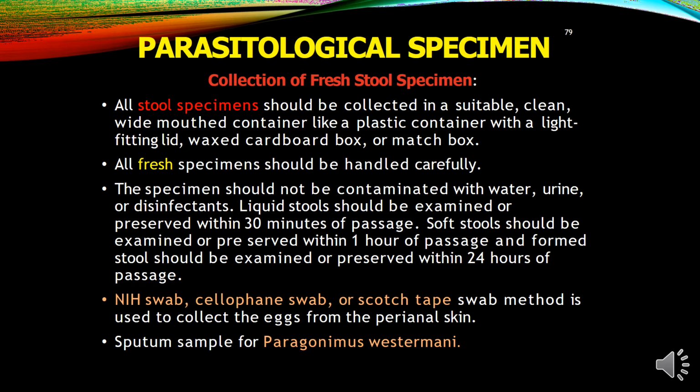Liquid stool should be examined immediately or preserved within 30 minutes after passage. Soft stool should be examined or preserved within 1 hour of passage. The NIH swab and cellophane tape or scotch tape technique is used to collect eggs in the perianal region. Sputum sample for Paragonimus westermani should be collected.